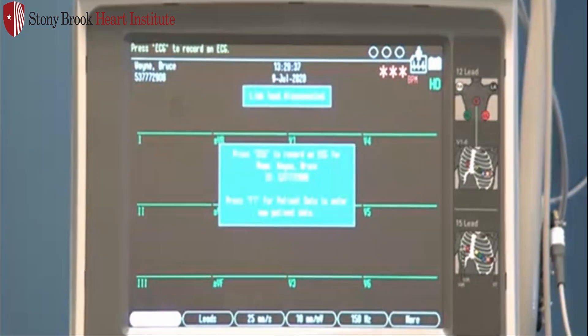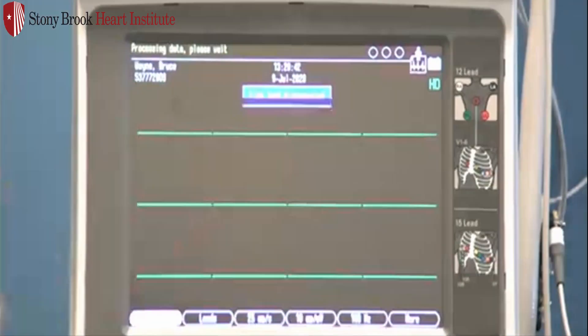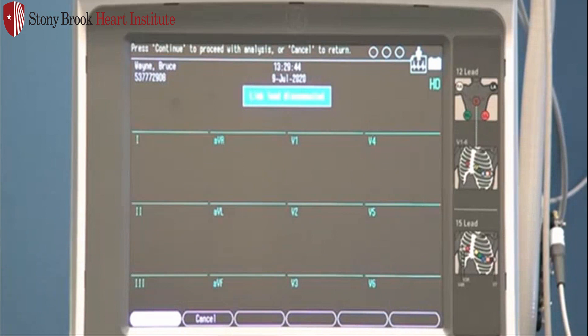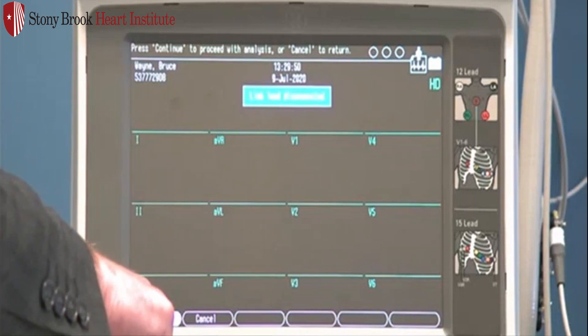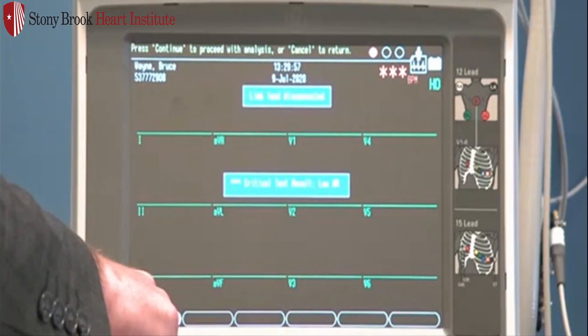Once you are ready to acquire again, press the ECG button again. It will give you a prompt saying press ECG to record for this patient. Press ECG again, and we are back on our Continue or Cancel preview screen. If we're satisfied with this shot, hit Continue or F1. If there are any critical test results, you will get a critical test result indication. Hit Continue to acknowledge.